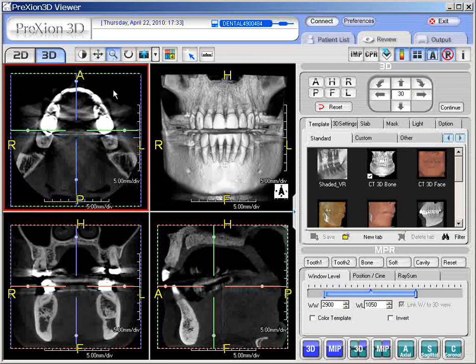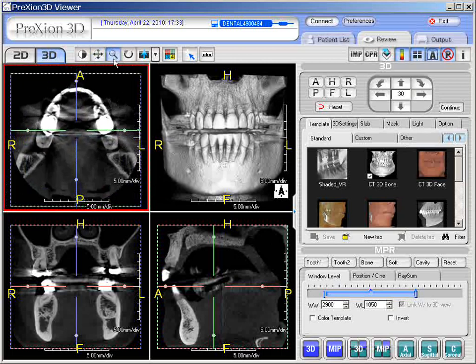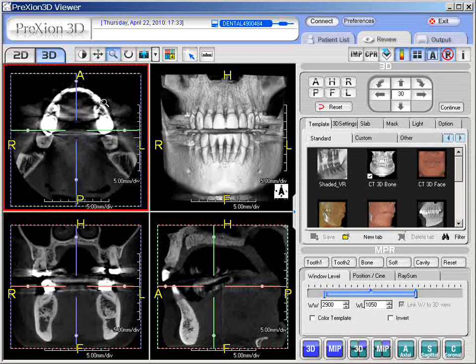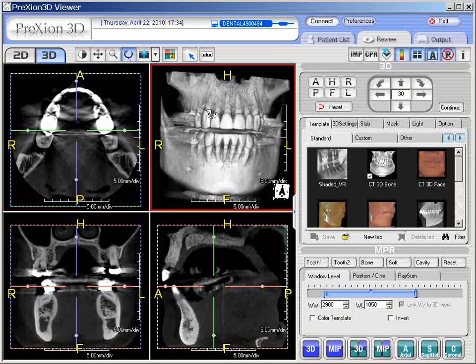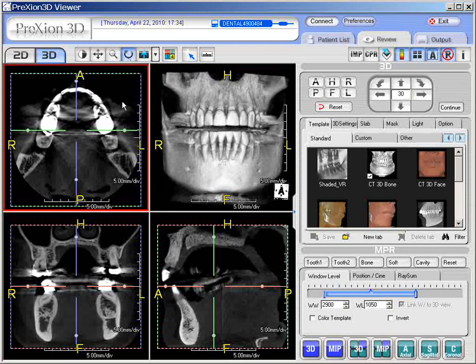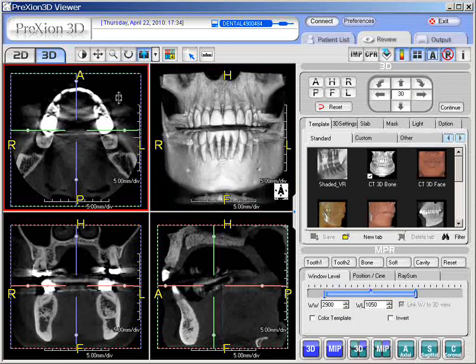For zoom, the default is the middle wheel and trackball, but once this icon is activated, the left click of the mouse becomes that feature. Back to the original defaults: rotate is only active with the 3D view and is the default setting — the left click of the mouse rotates the 3D image. Left click on the mouse for CT is used for slicing. That is the key difference.